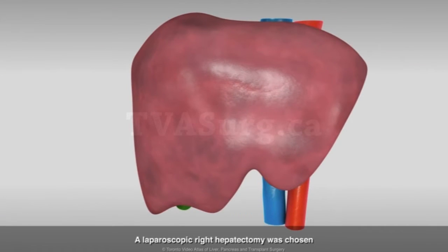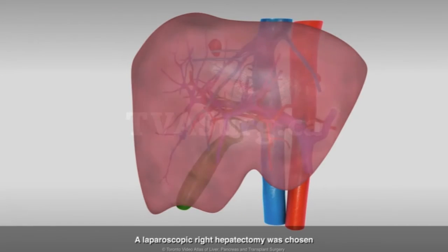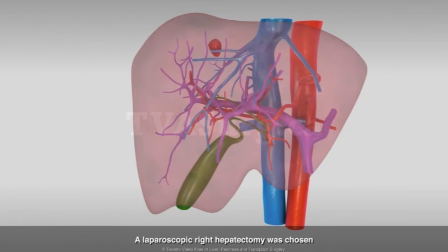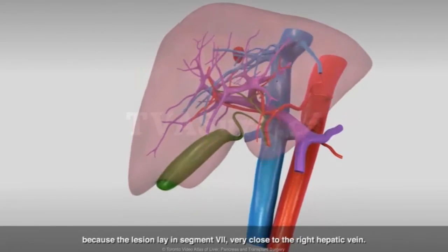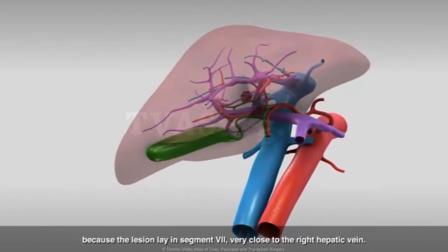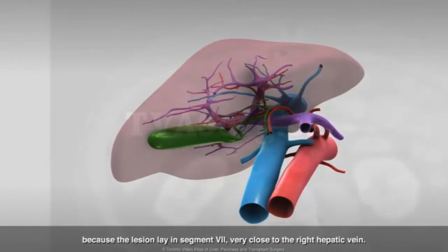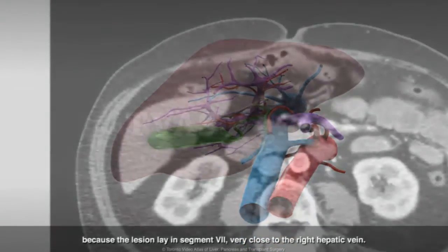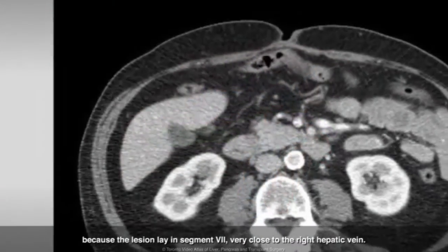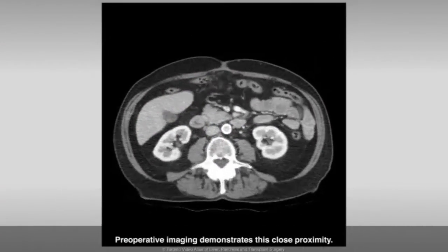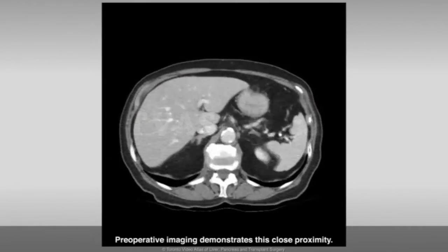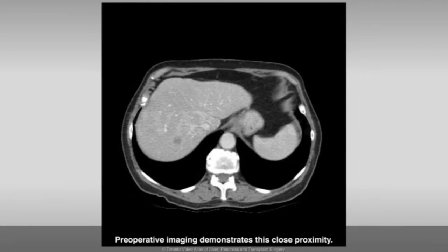A laparoscopic right hepatectomy was chosen because the lesion lay in segment 7, very close to the right hepatic vein. Preoperative imaging demonstrates this close proximity.